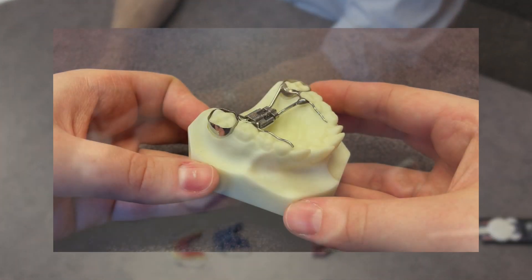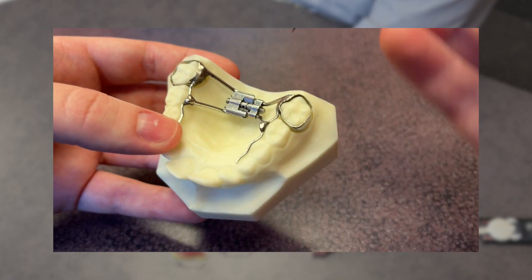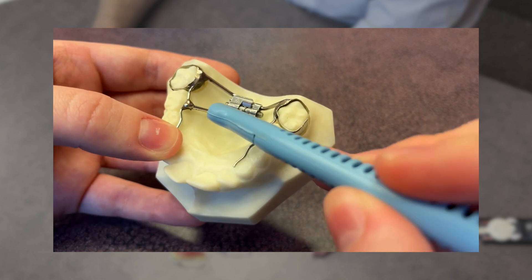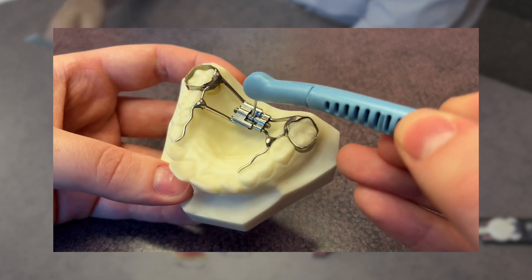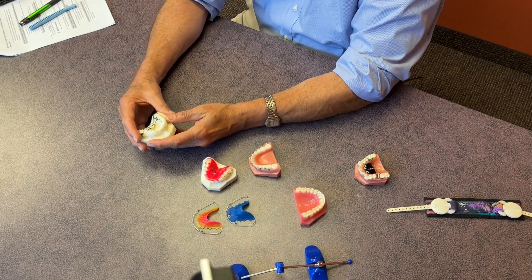That's the challenge for so many people, and why something fixed in place has greater appeal. Another fixed appliance we use is an expander. This one for the upper arch utilizes a key to make quarter-of-a-millimeter changes, typically once a day, to expand or widen the width of the maxillary arch. These are just some examples of fixed orthodontic appliances.